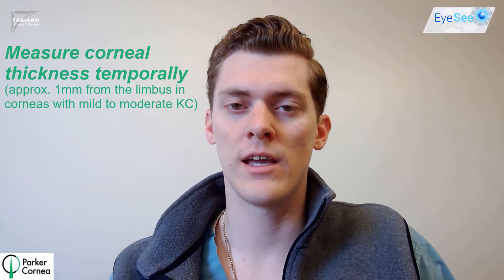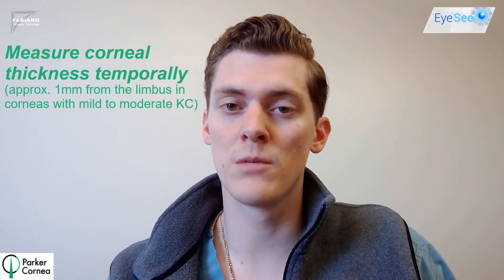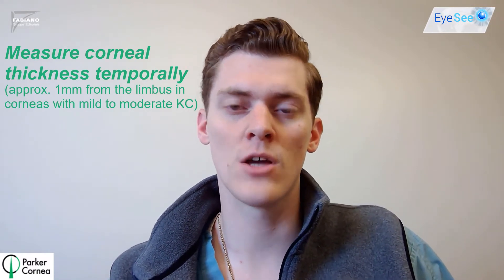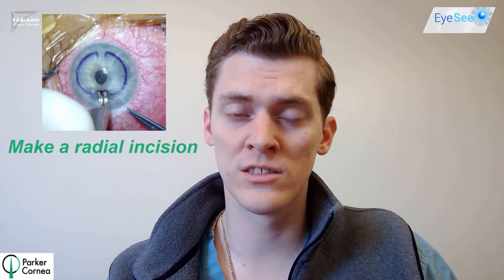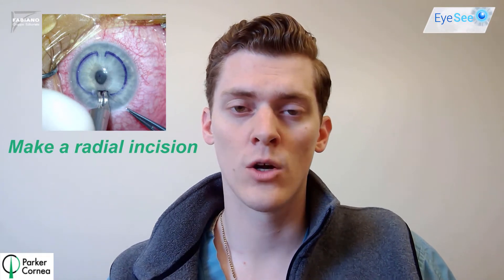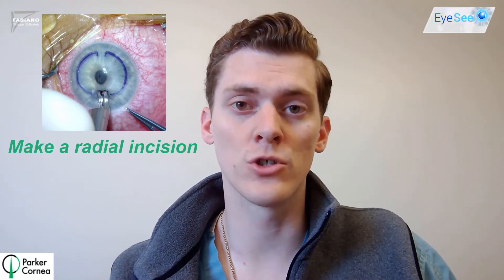We start by measuring the corneal thickness with a handheld pachymeter in the operating room just prior to the start of surgery, approximately one millimeter from the limbus where we anticipate we'll make the incision. Then we mark the cornea with gentian violet and make our radial incision using a guarded diamond blade, marking the cornea at approximately 80 percent depth of what we measured.